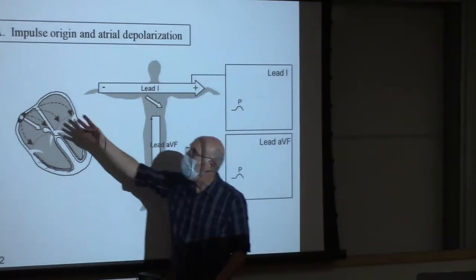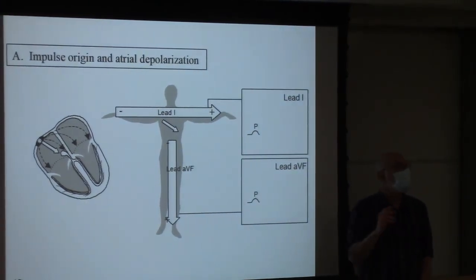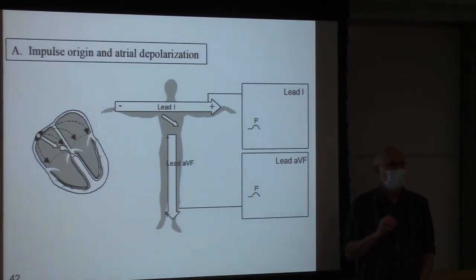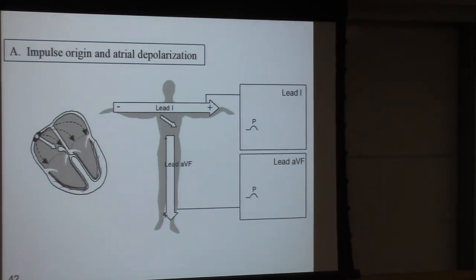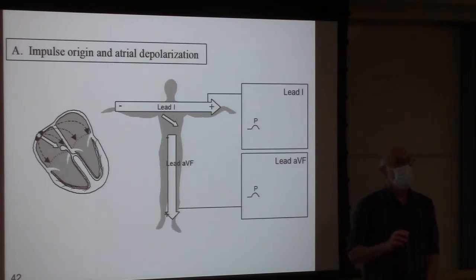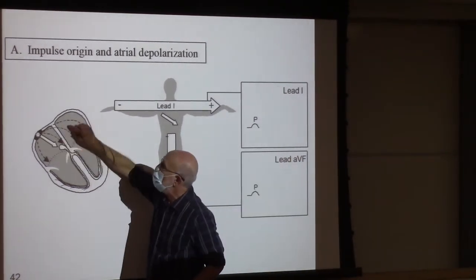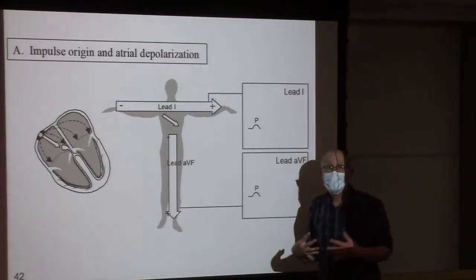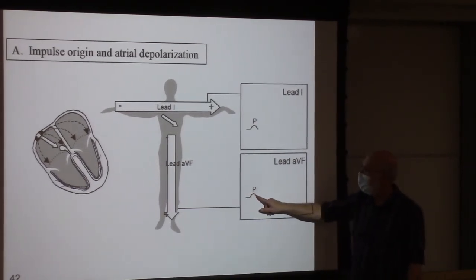So what happens in the heart after atrial depolarization? What's the next step? Yes, the action potential spreads into the atrioventricular node. Can we detect spread through the AV node? No. Why? Too small, too slow. So once the spread gets into the AV node, the signal gets too small to see, and it goes back to baseline. Goes to 0. So the spread is now invisible.